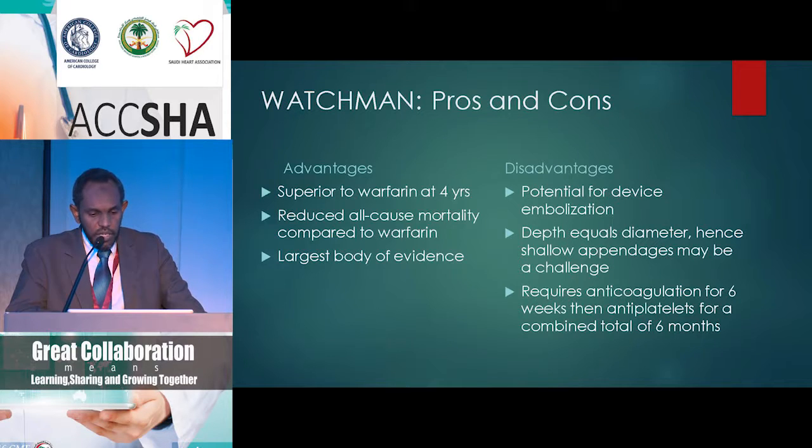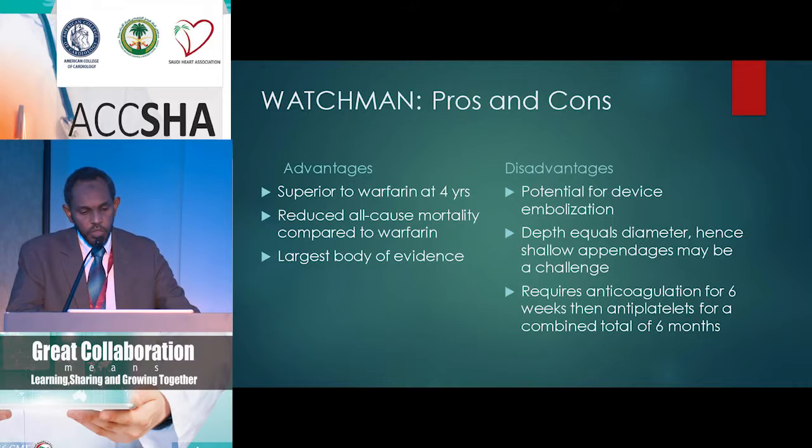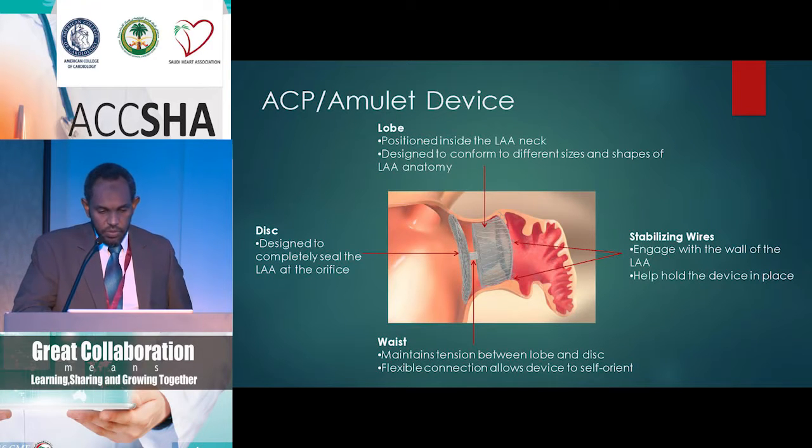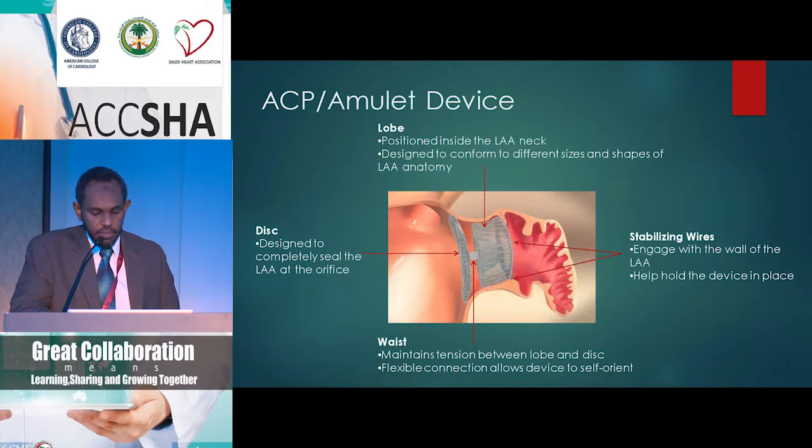And also it requires anticoagulation for 6 weeks to allow endothelialization. After that, you switch from Coumadin to antiplatelet therapy for a combined total of 6 months. So if you do need to get off anticoagulant or antiplatelet therapy very quickly because of bleeding concerns, that might be a hindrance with the WATCHMAN device.